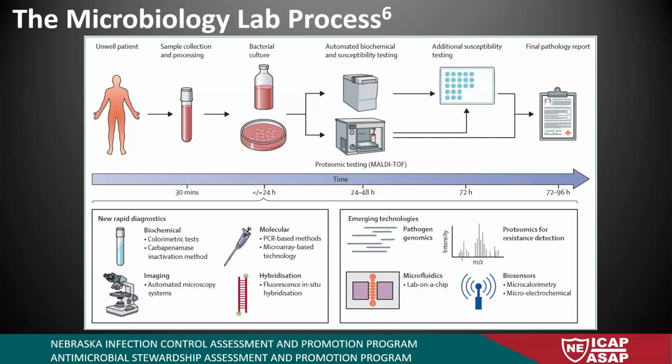Then they do usually some sort of bacterial culture, or there's other things they're looking for, like a fungal culture. Lately, there are a lot of automated processes that provide susceptibility testing. There's some other tests, like if you've ever heard of a MALDI-TOF, that's a lot of their favorite machines. It's a really big machine. I don't really know how it works, but it's really cool. And it looks really impressive when you see them. And then they do some sort of additional susceptibility testing, and then you get your final report.